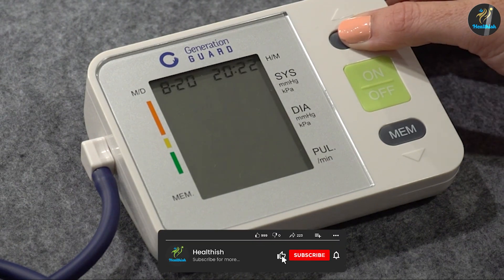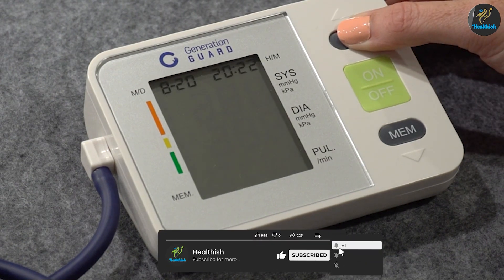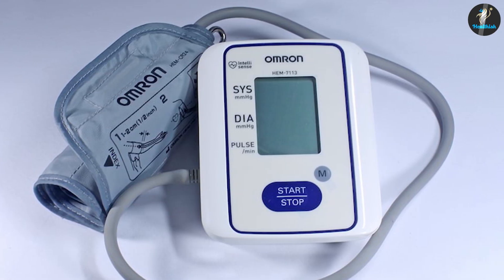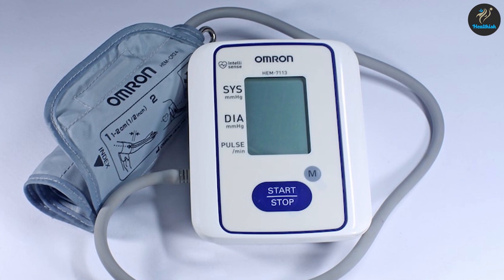An automatic unit, which is typically equipped with a wrist or upper arm cuff, has a large digital display. These units, in some cases, are less reliable than their manual counterparts.